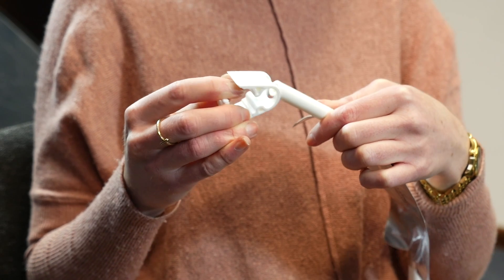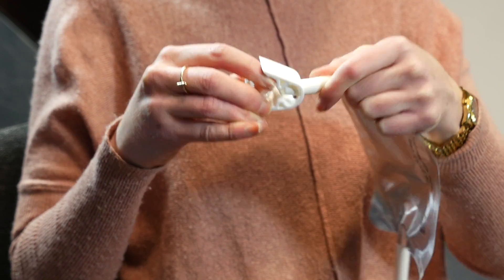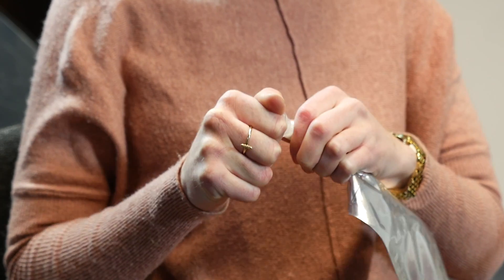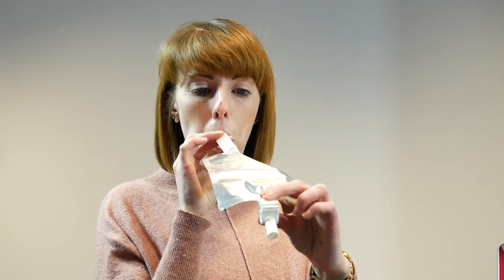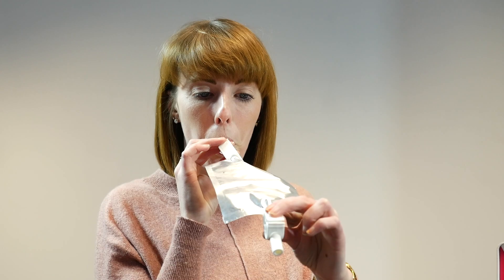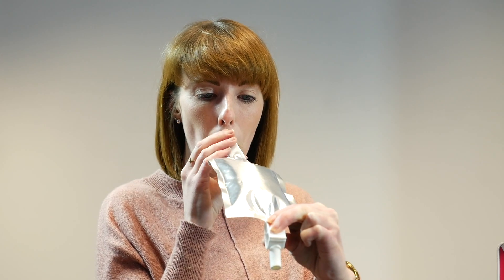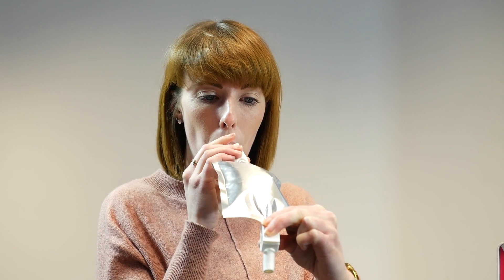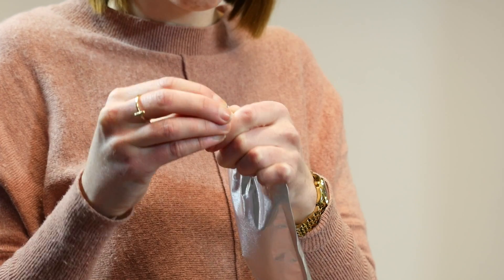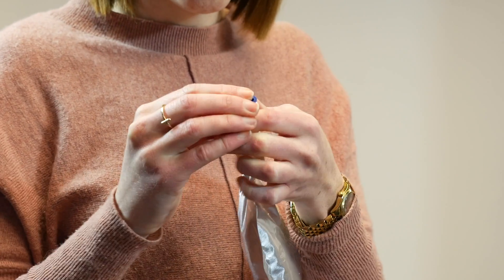To collect a breath bag sample, place two clamps on the inlet and outlet leaving them open. Attach a mouthpiece to the inlet and exhale gently into the bag until your lungs are nearly empty. When your lungs are nearly empty, close the clamp at the outlet, then continue breathing to fill the bag and close the clamp at the inlet.